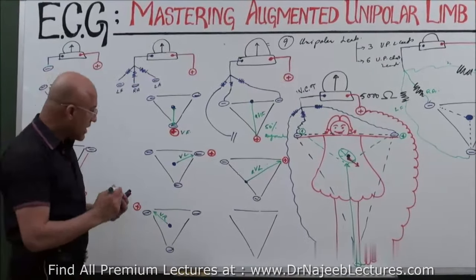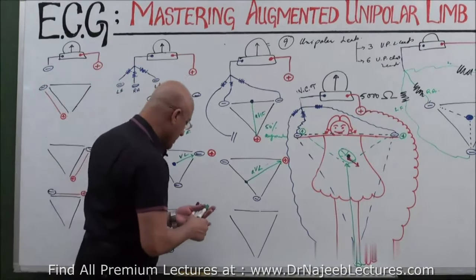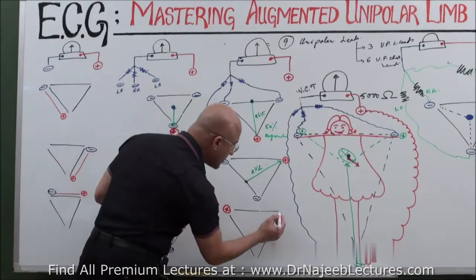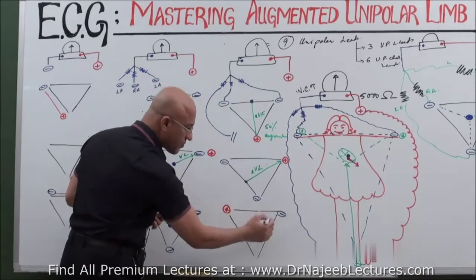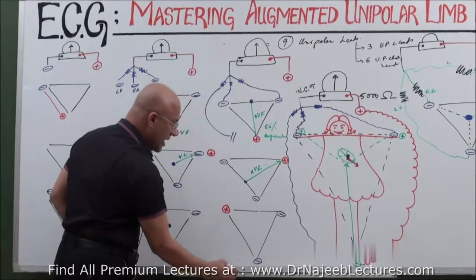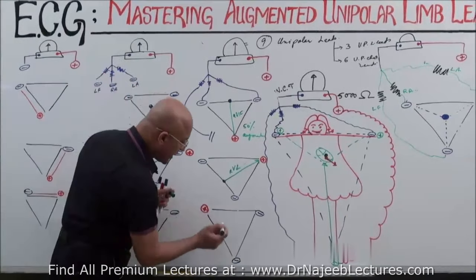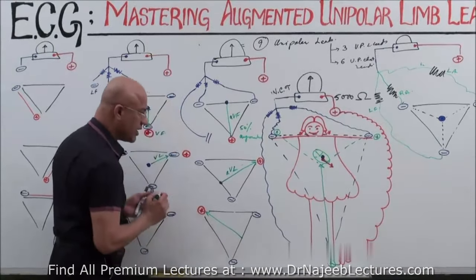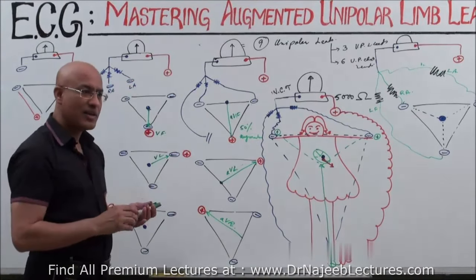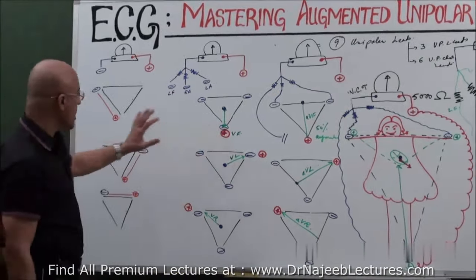Same, Goldberger played with this lead system also. How did he do it? Put a positive electrode here, connect the positive electrode here, and negative only on the left arm and left leg. Keep the positive, the exploring electrode, on the right. And in this way, he was able to achieve this lead. And what is this lead? AVR.